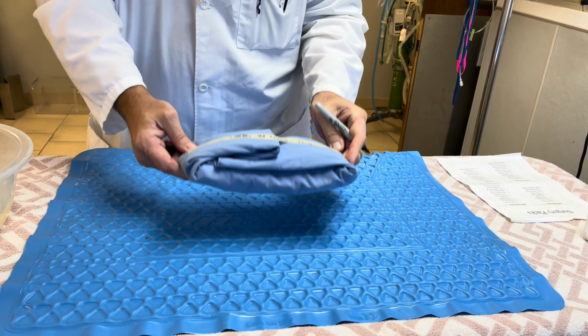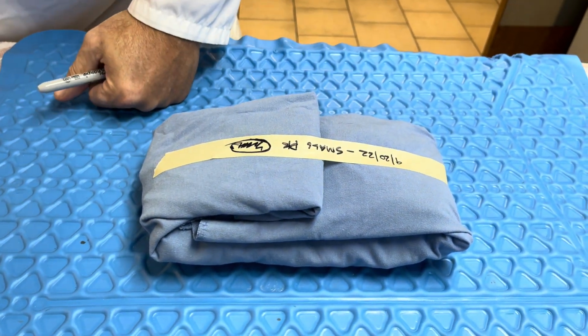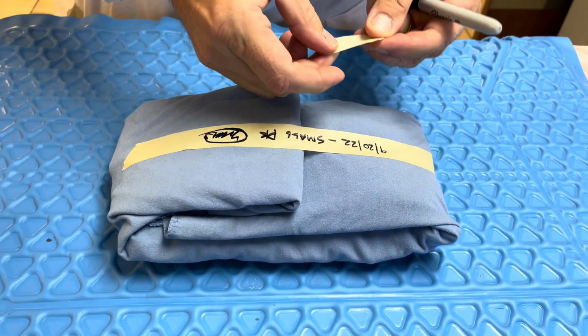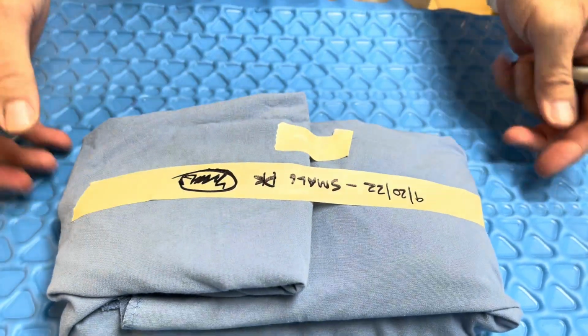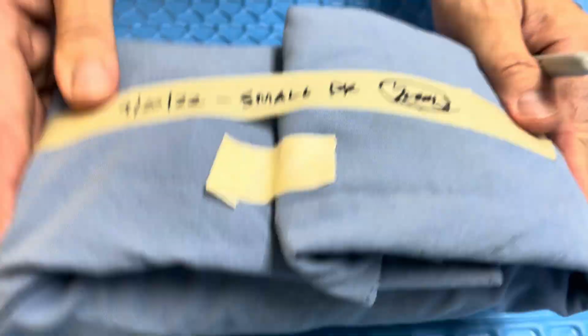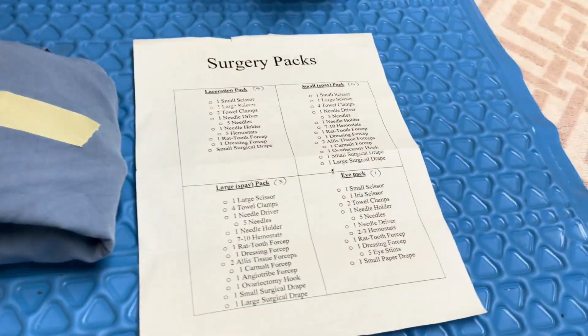your initials. And then there's also a little piece of tape right here, there it is. You have a roll of this. This is your steam indicator for our autoclave. That's it. Beautiful. That's the way to do it.